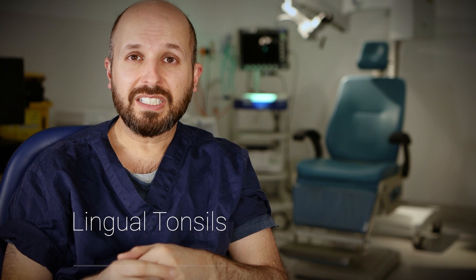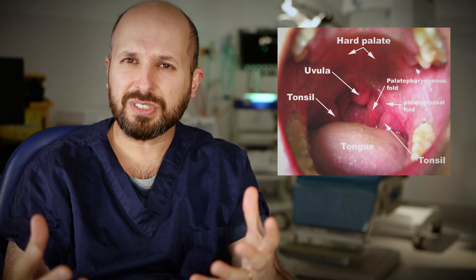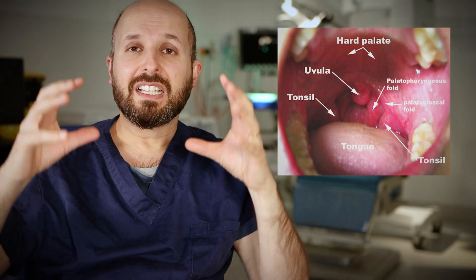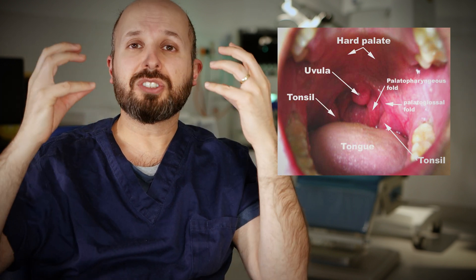I use radiofrequency ablation to shrink down lingual tonsils. Lingual tonsils sound like the palatine tonsils — the ones that everyone knows about, which sit on either side of your mouth, and people get tonsillitis from those. There are lots of different types of tonsils. The lingual tonsils are actually connected to those palatine tonsils, and they sit just there. These two tonsils aren't separated; they actually connect through the back of the tongue, going down across the back of the tongue and sitting in the back wall of your throat.